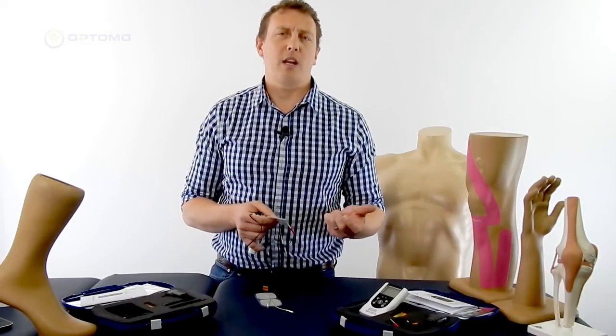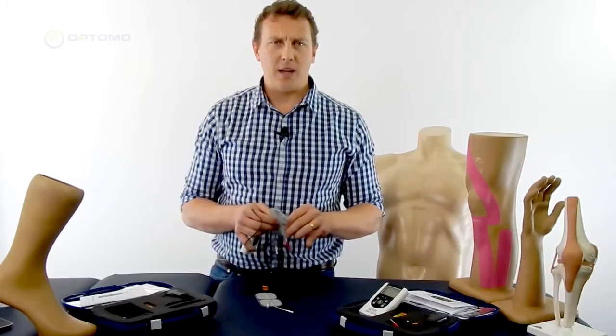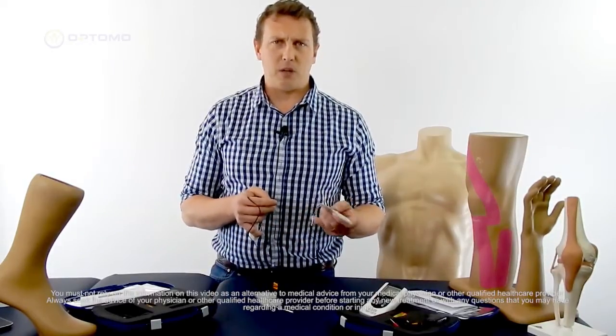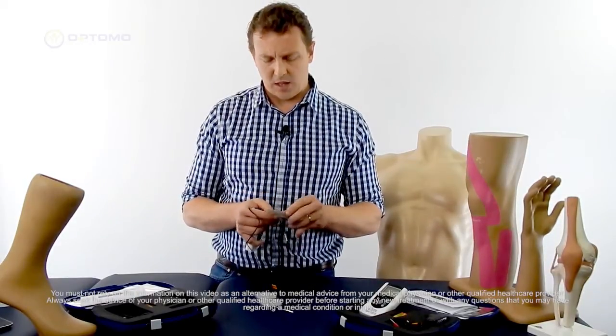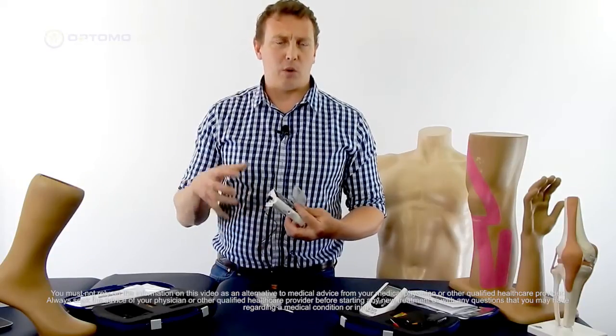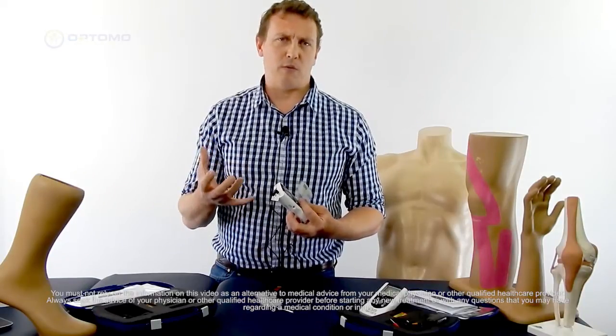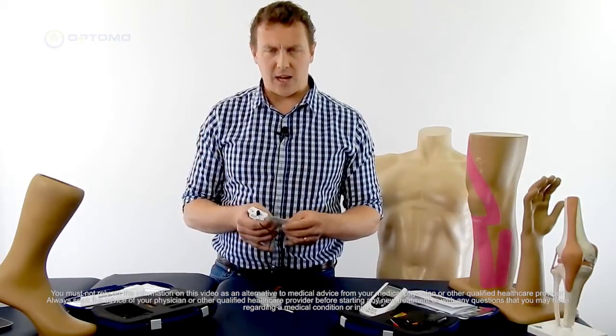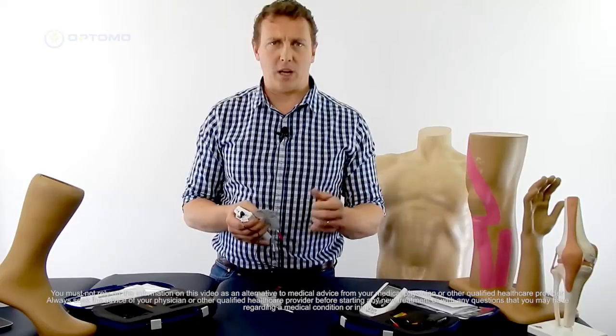Ideally, the negative electrode should be over the motor point and the positive electrode should be at the other end of the muscle. That will recruit the most muscle fibers and give the best contraction to really work that muscle.